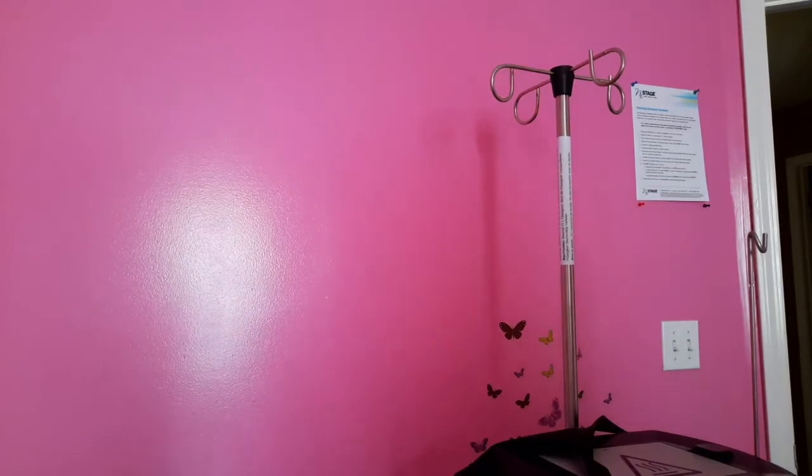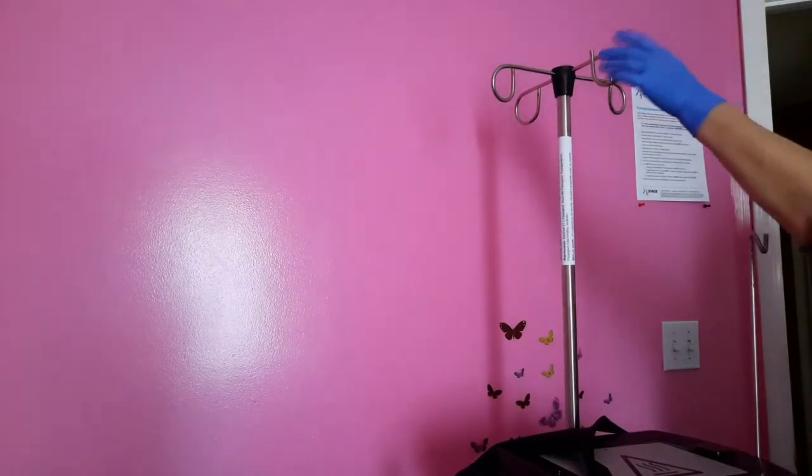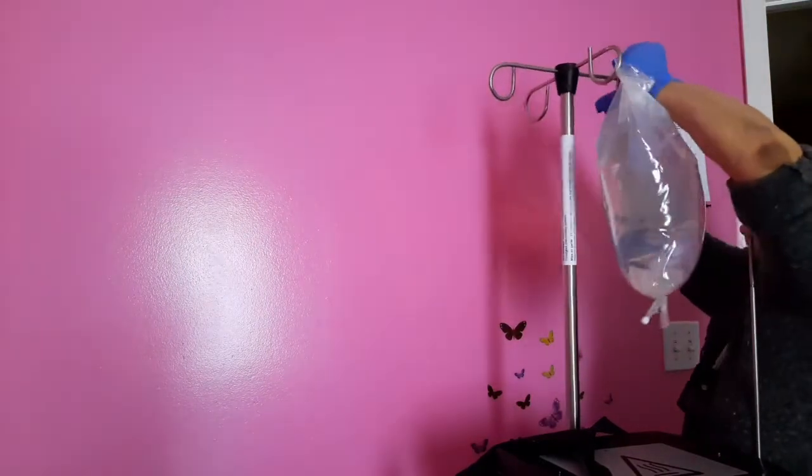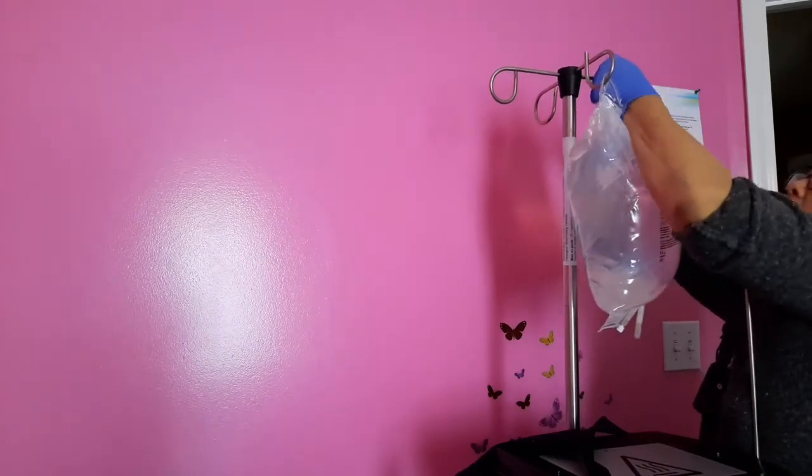Okay, now that we have all the bags unwrapped, and we've checked the date, checked for leaks, and checked that it was 5,000 milliliters, we're going to hang them up here on the drip post, whatever you want to call it. It's got two little holes on the top of the bag, one on each corner, and you just hang them up.